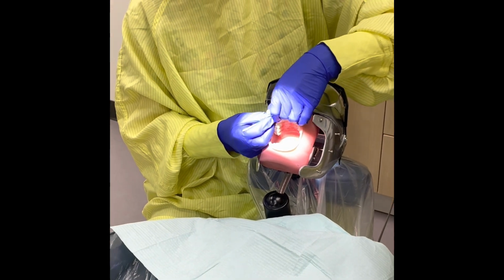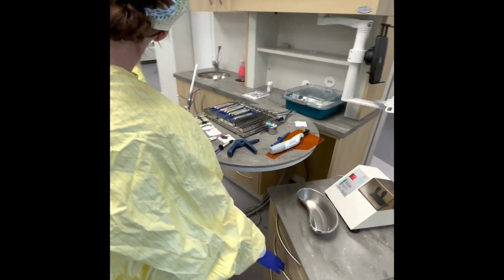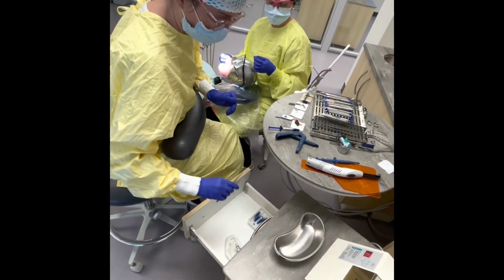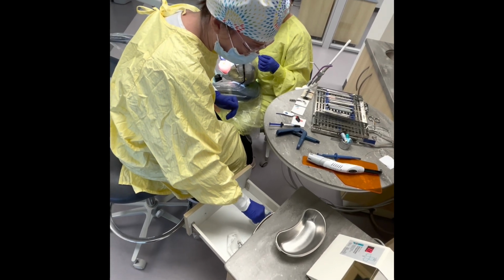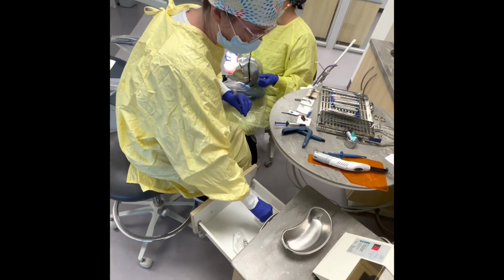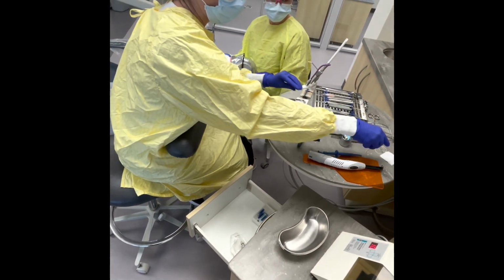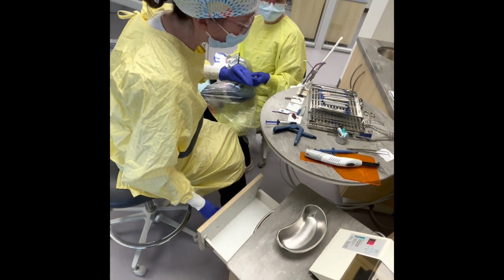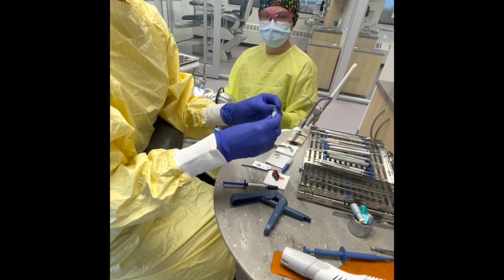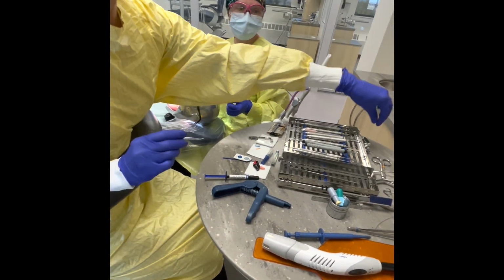And what can I assemble for you, Amanda? I would like a blue tip, Stacey, and an ultracane, please. Okay, so with my marked cotton tip pliers, I am going to go in and grab a blue tip. I'm going to make sure I don't touch the inside of the drawer with my gloves, and I will grab the anesthetic and put my marked cotton pliers back out there. I'm going to ensure that the correct date is within the expiry date. Awesome. And so now I'm going to assemble my syringe.